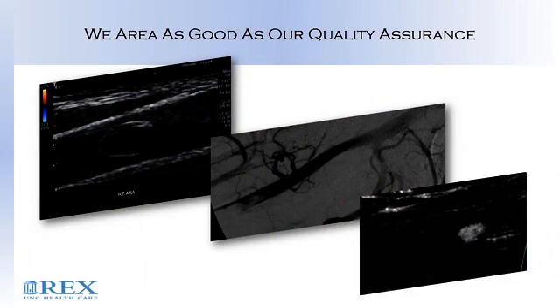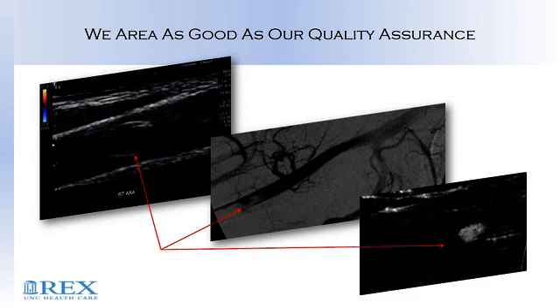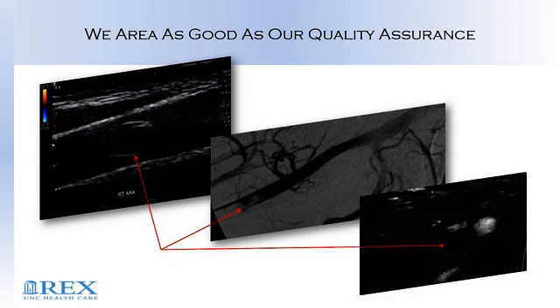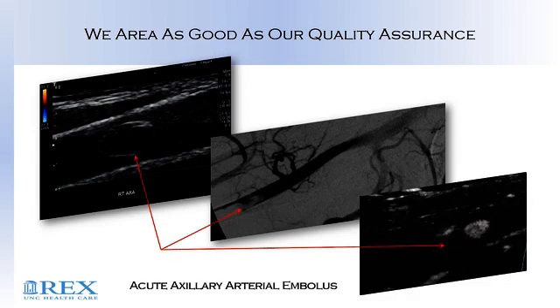This patient came to our ER with no pulses in the right arm. If we look at the first and second image, this is acute arterial embolus. Our third image is secondary imaging with SMI, and you can see the delineation around the thrombus.